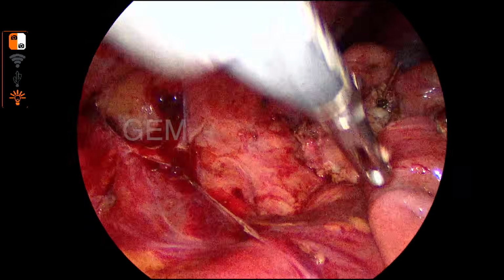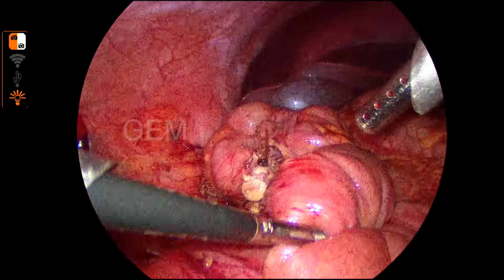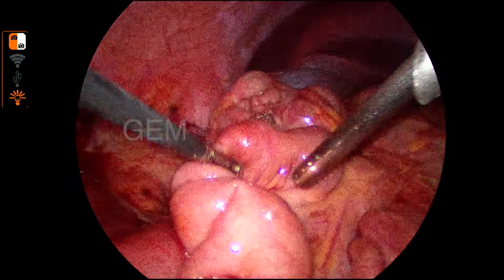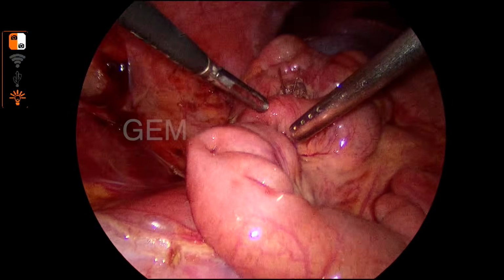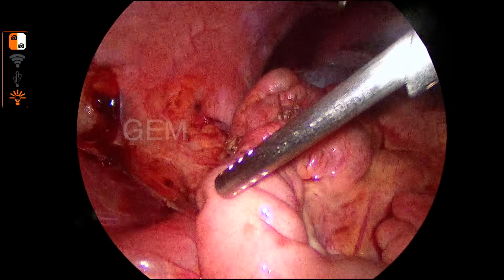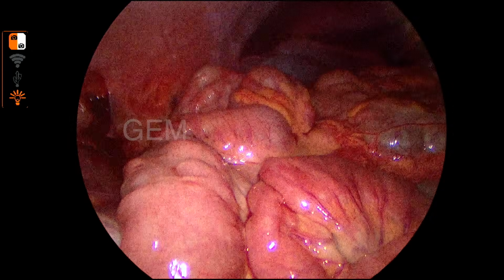So without mobilization of the cecum, you cannot do this surgery. Even if you rotate the cecum, if you mobilize laterally and then rotate also, you will not get a good exposure. And now you can see how much exposure we get from the suprapubic port. So this is a real advantage of the suprapubic port for a retrocecal appendix.